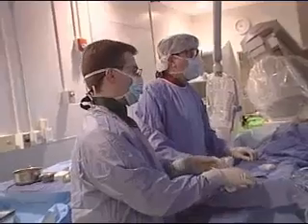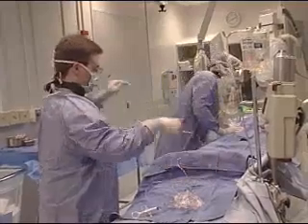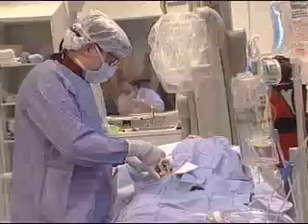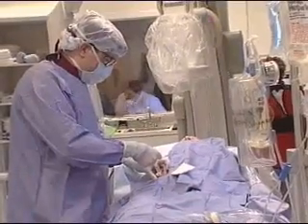Well, the Cypher stent, in my opinion, is a breakthrough technology. This is a technology that deals with a problem that we've been trying to solve for more than 20 years, the problem of reblocking a blood vessel, a coronary blood vessel, after it's been treated with a balloon angioplasty or a regular stent. With the Cypher stent, rather than having a reblockage rate of, say, 15 or 20%, which would be the typical bare stent, we're looking at a reblockage rate requiring retreatment in the range of 1 or 2%, about a 10-fold improvement over bare stents.